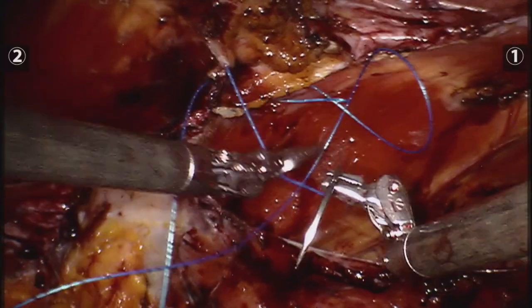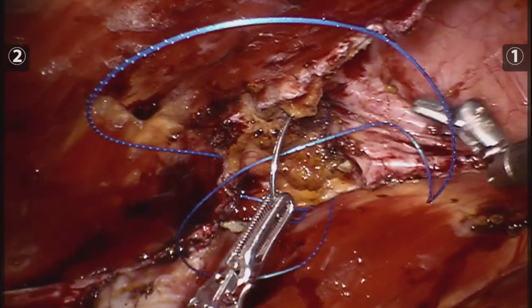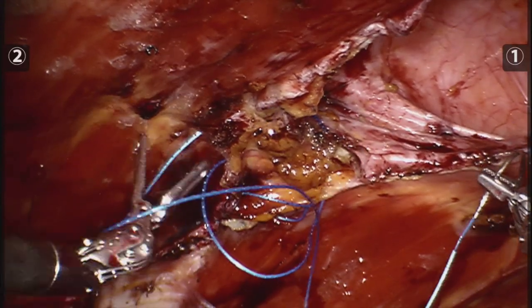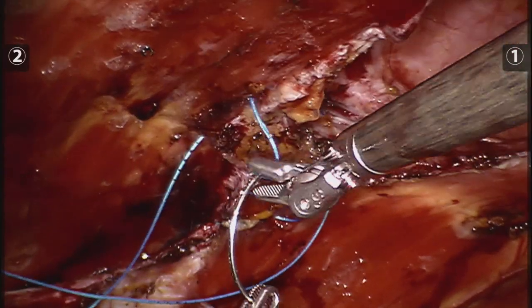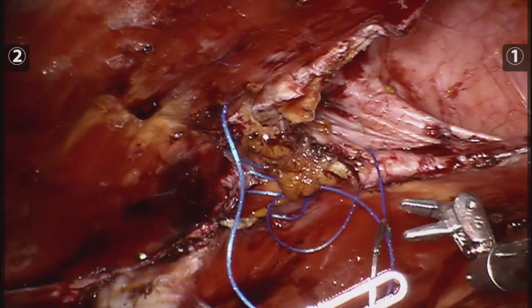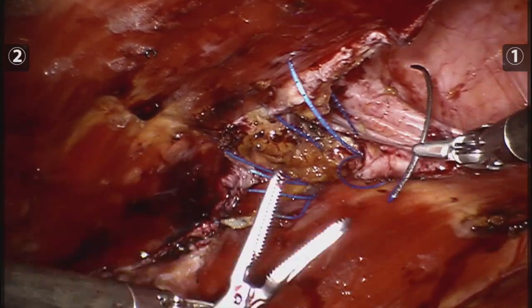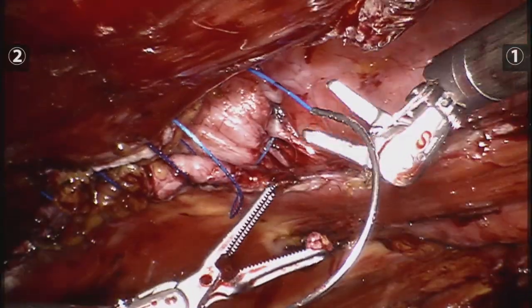Finally we got to the other very challenging part of the surgery that I was very hesitant about doing with the robot — I didn't know if I was going to be able to close the fascia. So I started on the upper vertices of the hernia, and my plan was to make a few throws and tighten slowly to see if the defect came together, which — luckily for everyone in the OR who were already very tired — worked out very well.